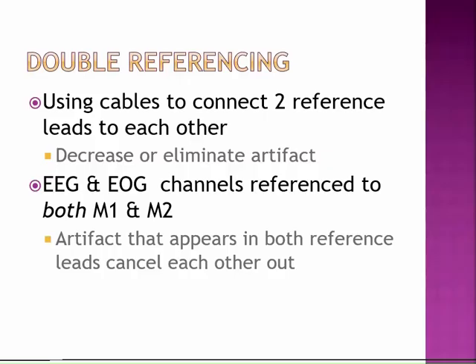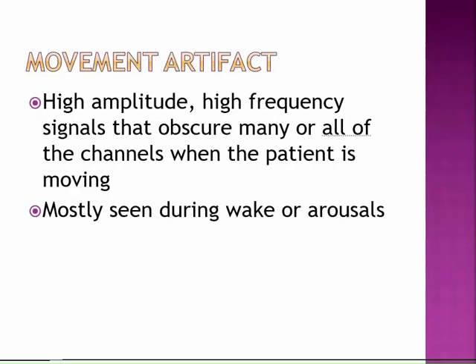All right. Hopefully you wrote that one down, because I feel like I just said it four to five times, so probably important. Movement artifact.